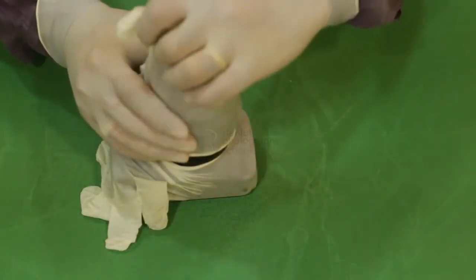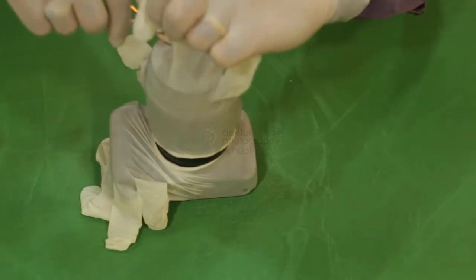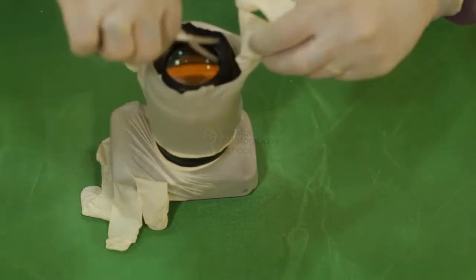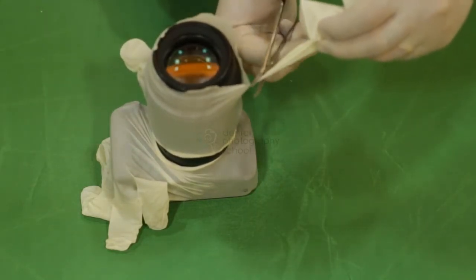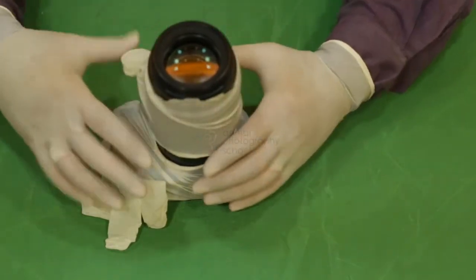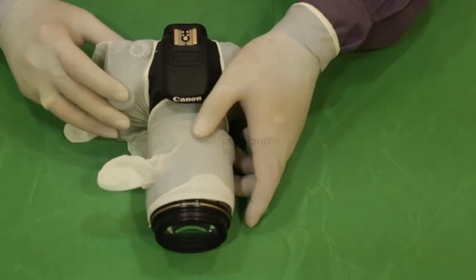Now, we have these finger extensions on the glove. All you need to do is cut them loose. If you have excess glove material coming over your lens, just roll it back, and your DSLR is ready to go. Please ensure to confirm that your magnification ratio has not changed.